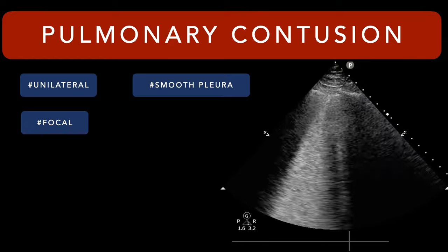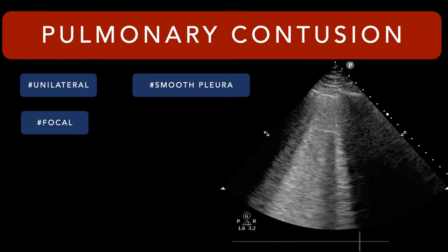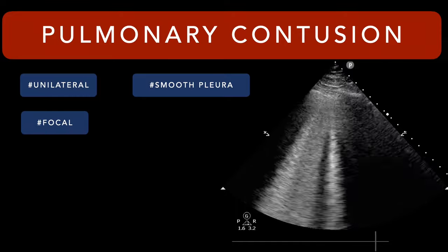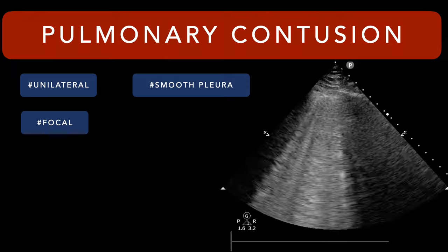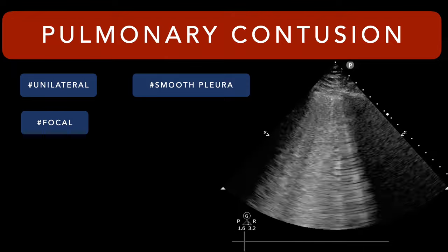And so this is the exercise I want to walk us through. The paper spends a little bit of time talking about this, where what are the findings? What are these nuances that you can see? How does that, plus the clinical scenario, then guide your decision making in terms of what's causing this?